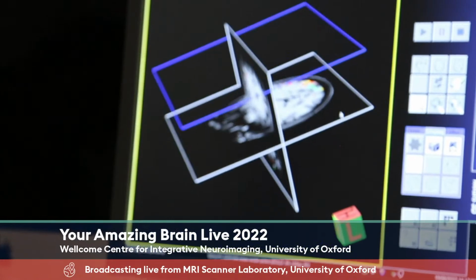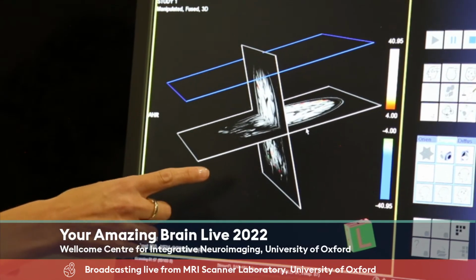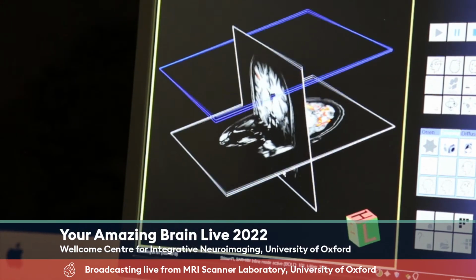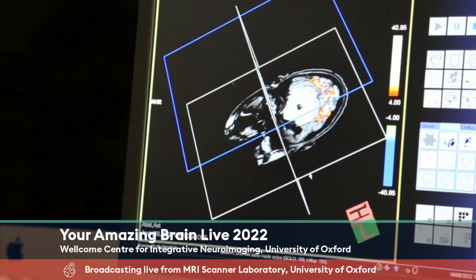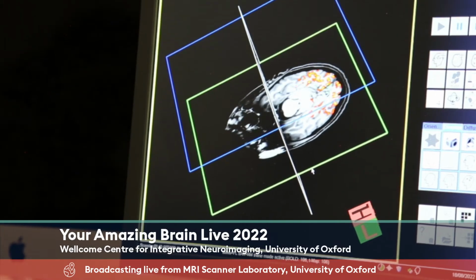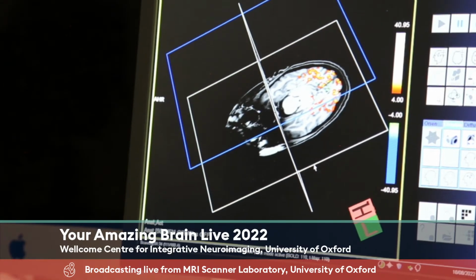What Stuart is showing here on the screen is now a color on top of the structure of Barbara's brain. You can see in some red and yellow colors that at the back of the brain, in the visual cortex, there's some activity happening right now, live, as she's looking at the picture of the octopus. So that's what she's looking at, but is that about her being afraid of octopuses?